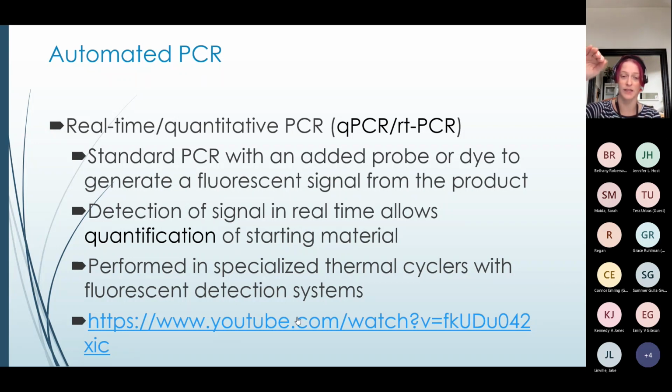Wherever that sample falls on the standard curve as it gets generated is 30,000, and it uses that standard to quantify viral loads in all of your other patients. We don't do anything else besides CMV, EBV, BK at the moment, but we're bringing up adenovirus as well. That's something we're currently working on.